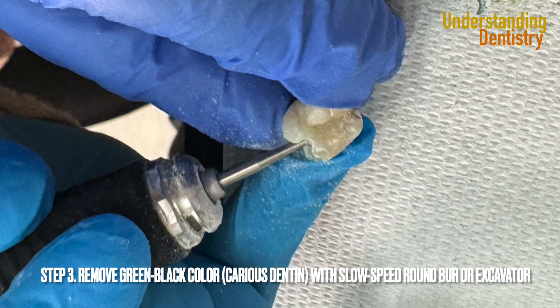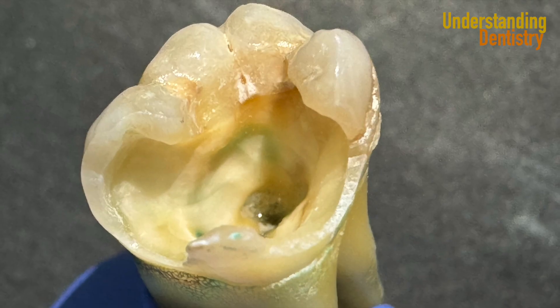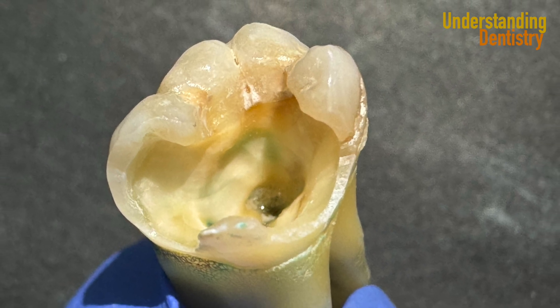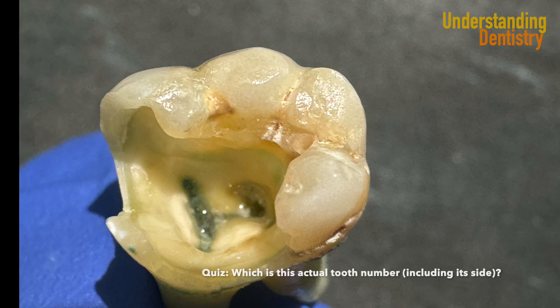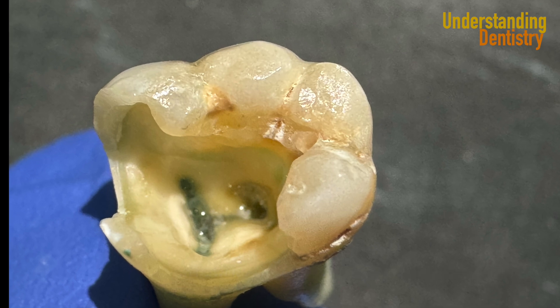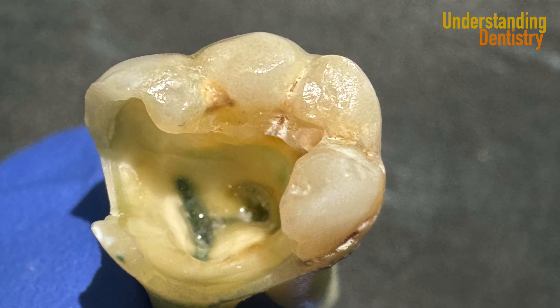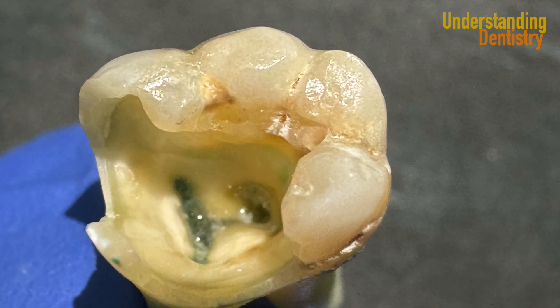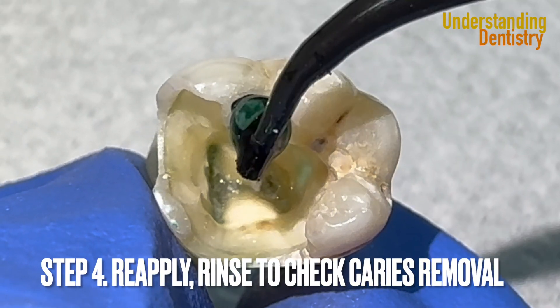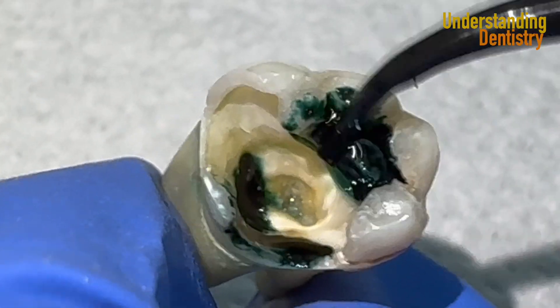Now we need to remove the caries — especially all the black-green color. Then take a look at the very nice dry-looking aspect of the dentin. You can actually use the product again to check if all the caries was removed. There are still caries below the distal cusp, so we are going to apply again — even though the root canal is already exposed because this is just an extracted tooth — just to show that we will still find caries underneath the distal cusp, which is the cusp on the right side of the screen.